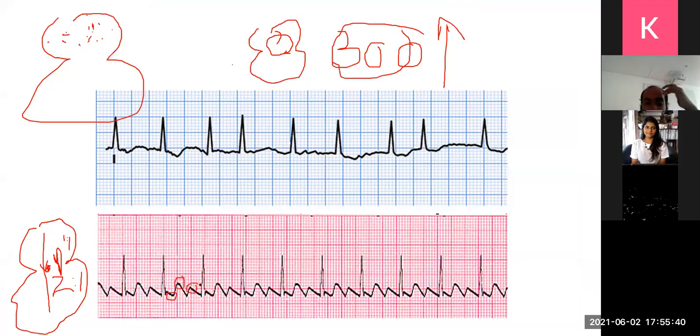Okay, experience වලින් එනවා බය වෙන්න. ECG බලනකොට ඔක පුළුවන් වෙනවා. සමහර ටිකක් අමාරුයි. හරි. So in this ECG, this is the T wave, this is the P wave.